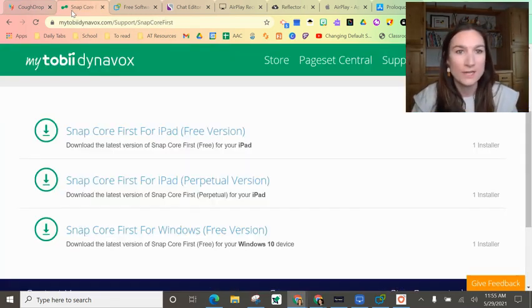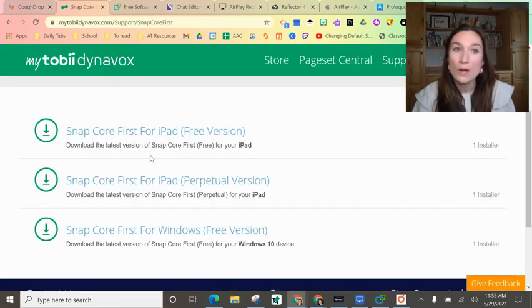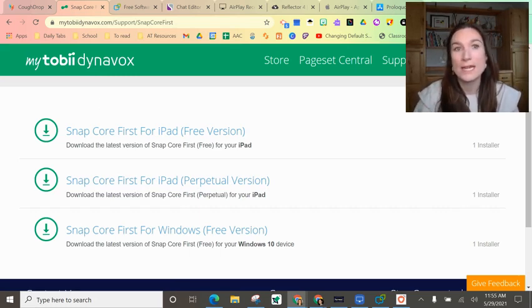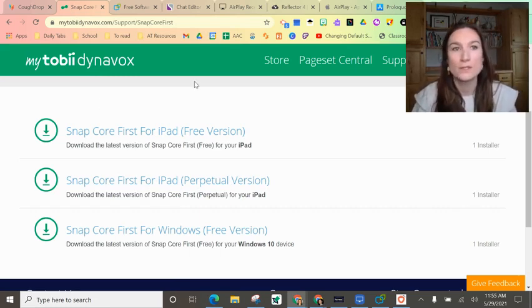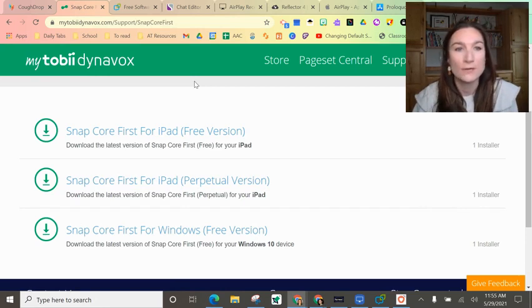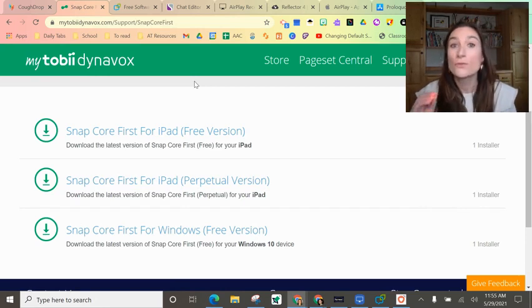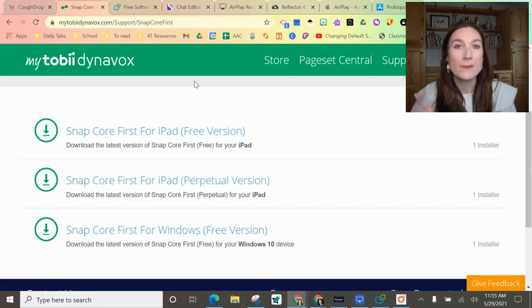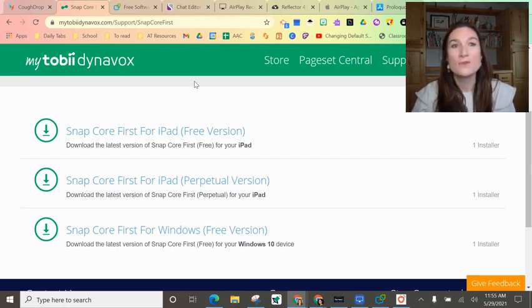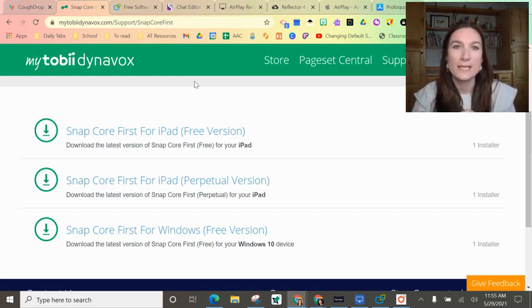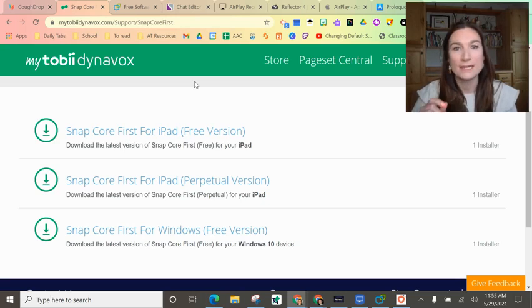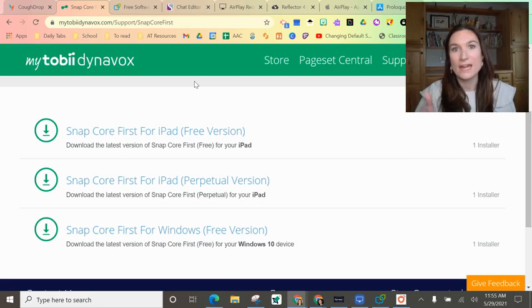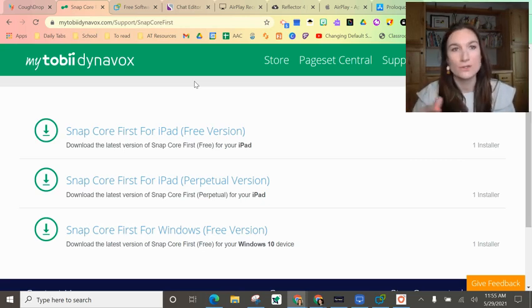Next, let's look at Snapcore. This one you used to download in the Windows store, and now you just go to the MyTobii Dynavox website and you can download it there for free. The free version doesn't have voice output, but if you're an SLP you can log into their website and get access to one free voice. If you sign in with that account on your computer, you can get voice on your computer.